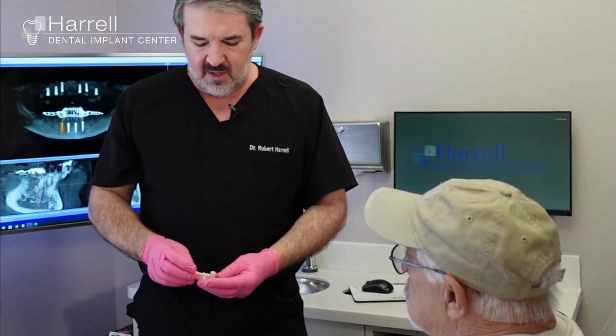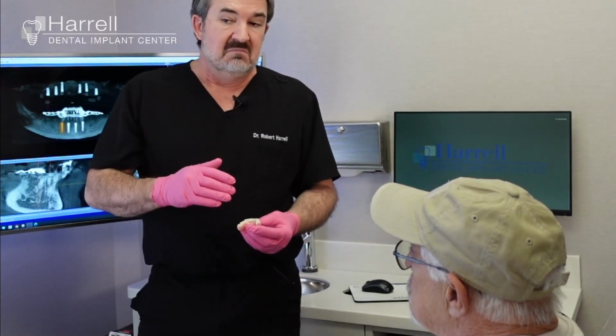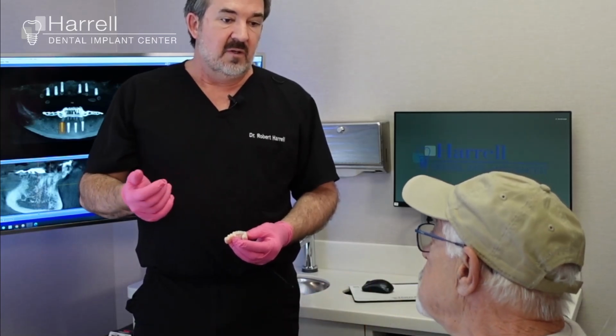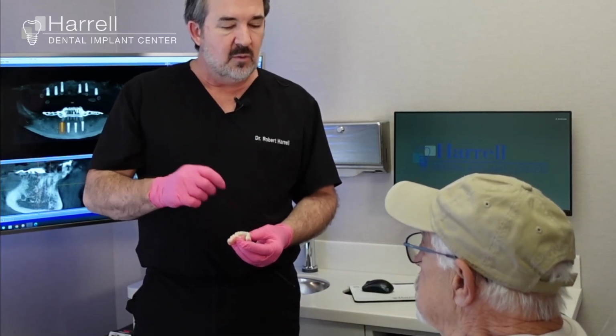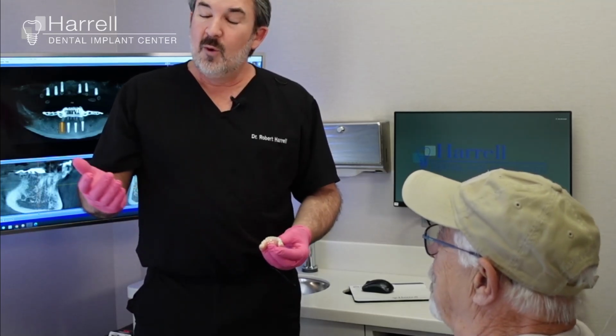The only thing you may find that you have to deal with down the road is once in a while we'll see somebody show up and they say, something's loose. Well, that just means that one of the screws has loosened up a little bit. We just open that up, go back in and tighten it right back. Send it back.